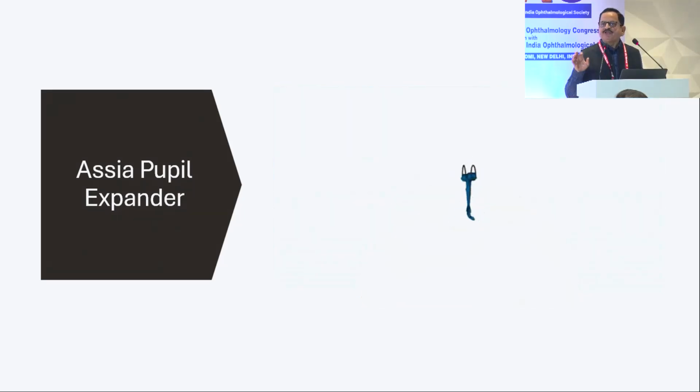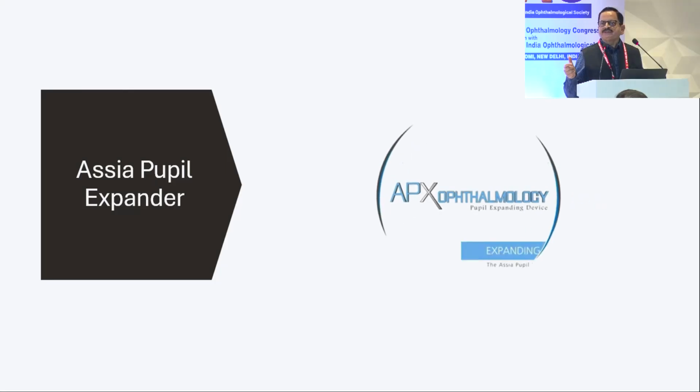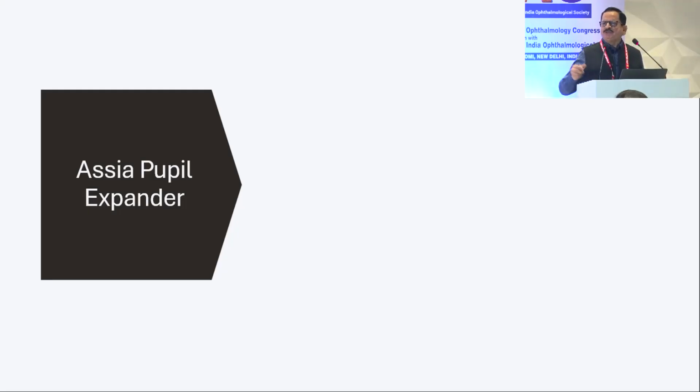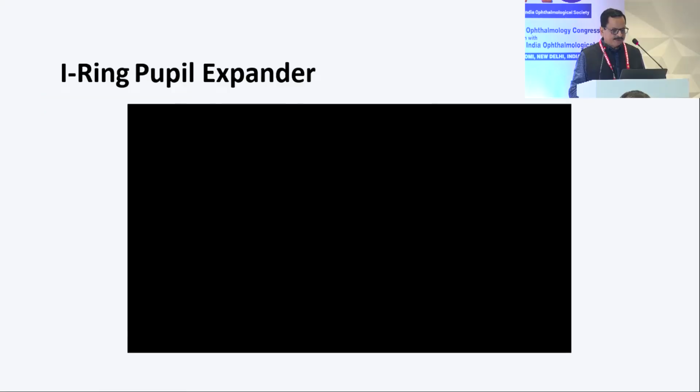So these are very tiny, and the beauty is you don't require any intraocular manipulation. You don't have to put a second instrument inside the chamber. It's not required. Although it is dilating too much, if you feel like you can put another one, but I don't think it's required, because you got a good square opening there in the pupil.